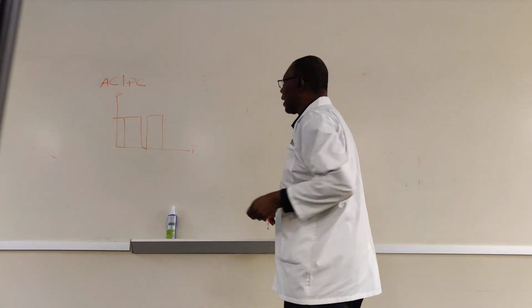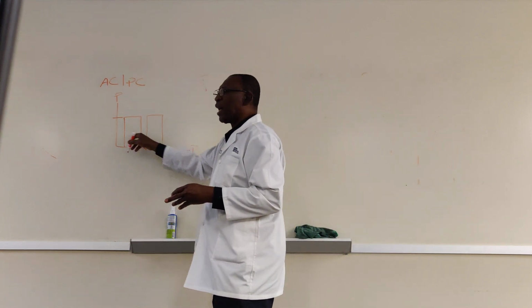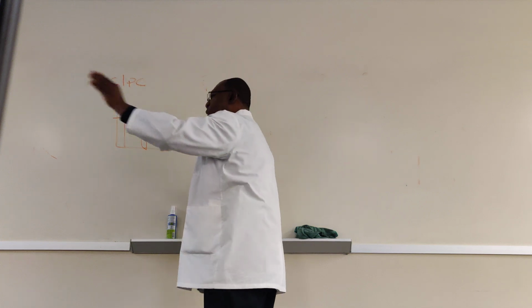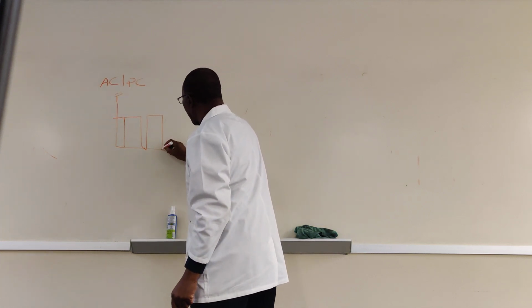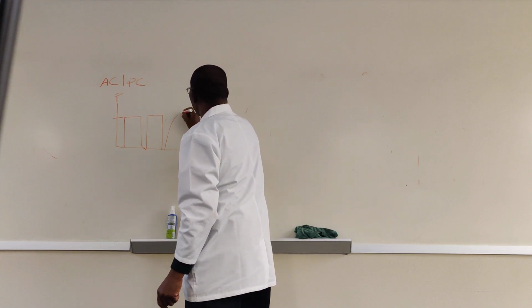Okay. Let's say that now you decide to set your rise time. This is without rise time. It's going to shoot out straight like that. If I have rise time, then it's going to go like that, but the pressure will still be the same.